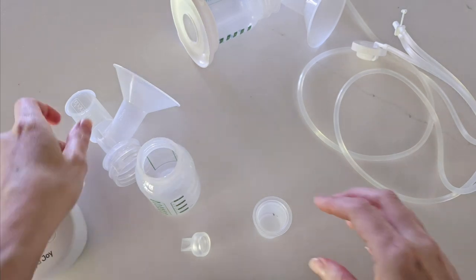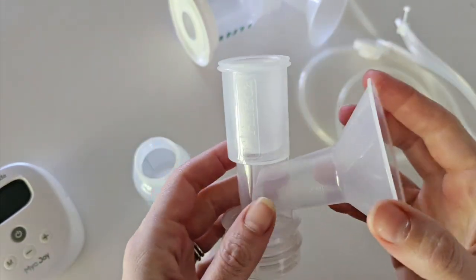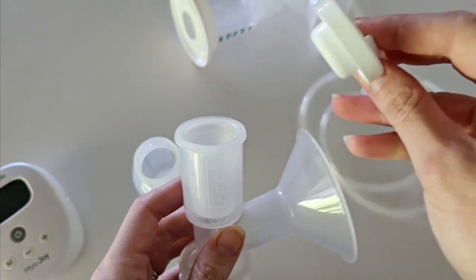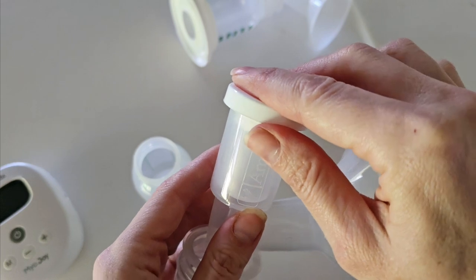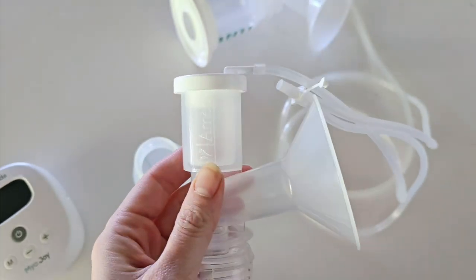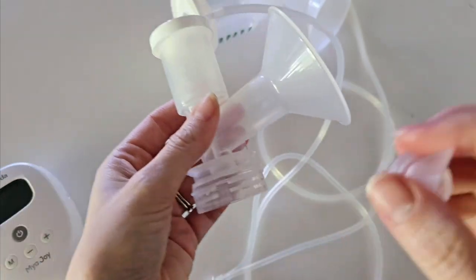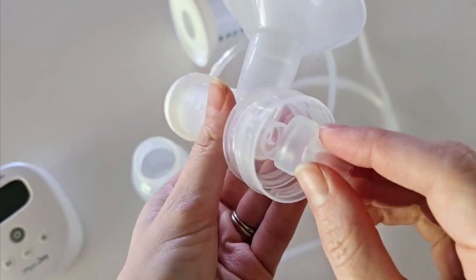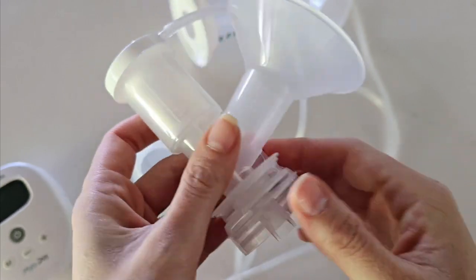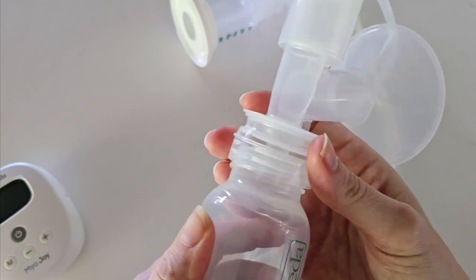First, take your diaphragm and place it into the top of your flange — make sure it's on nice and firm. Secure that with your tubing cap, which clips firmly into place. Then take your duckbill valve and attach it to the bottom of your flange — that just pushes on nice and firm — and then this screws onto your bottle.